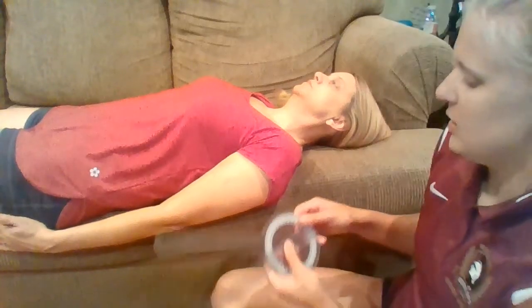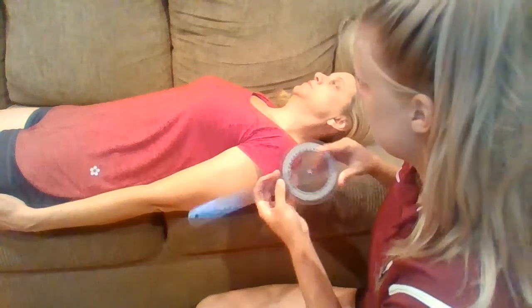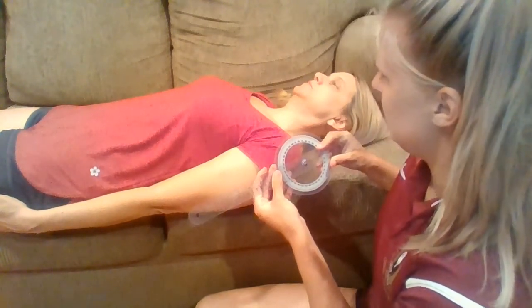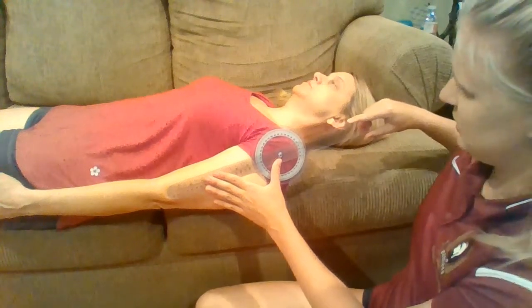Next, we are going to measure the flexibility of the shoulder when it is being flexed. The center point of the goniometer is going to be at the humeral head, and the movable part of the goniometer is going to be in line with the humerus. The immovable part is just going to be a continuation of the midline of the body.